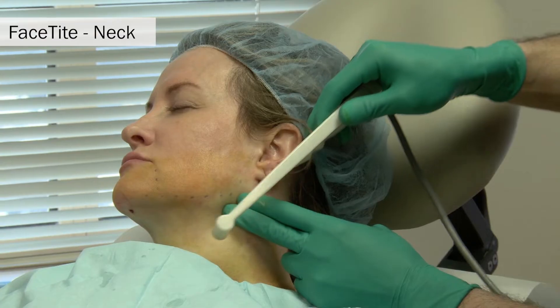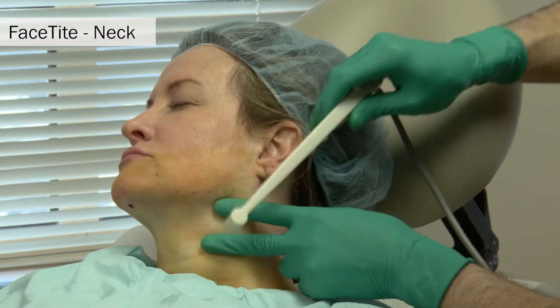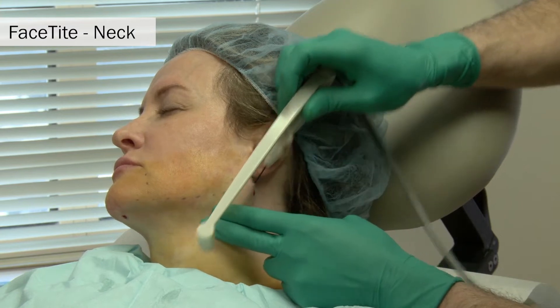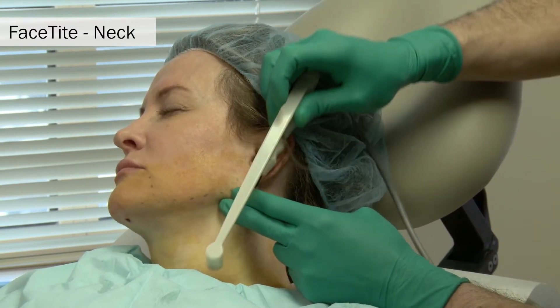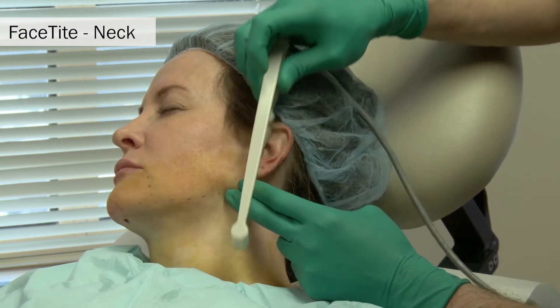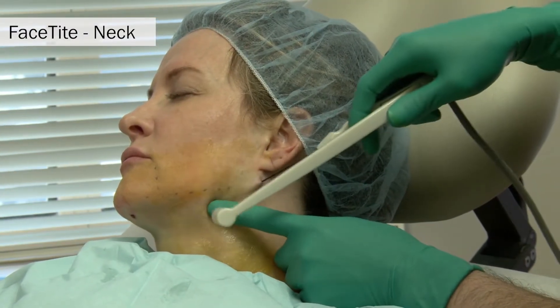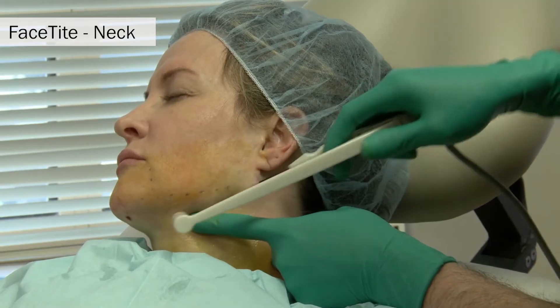Dry passes are made through the porthole laterally to allow the probe to slide underneath the surface of the skin in a pre-platysmal fashion. This ensures that the probe does not get hung up on the fibroseptal network underneath the skin as it is passed when heat is applied.